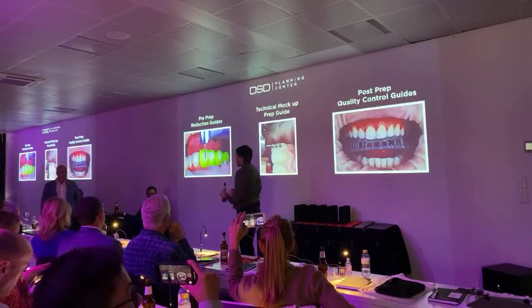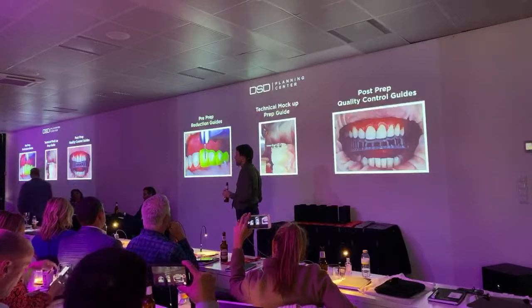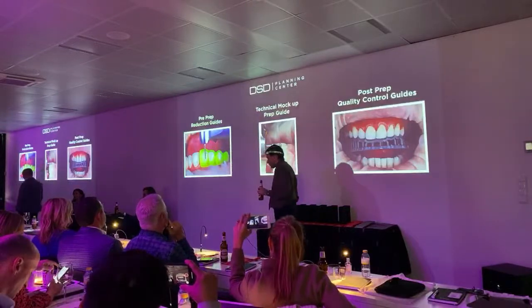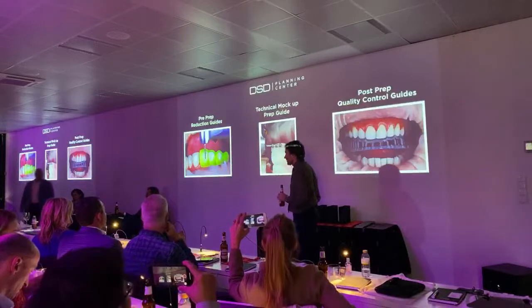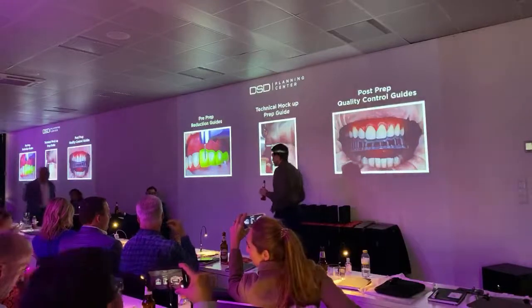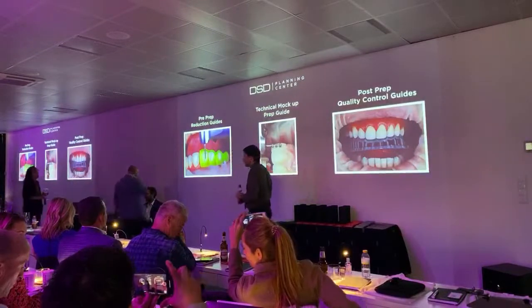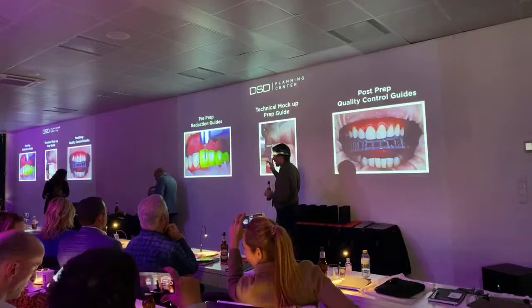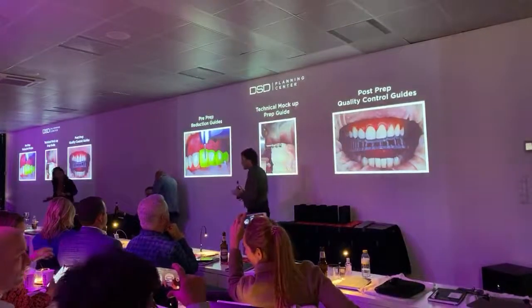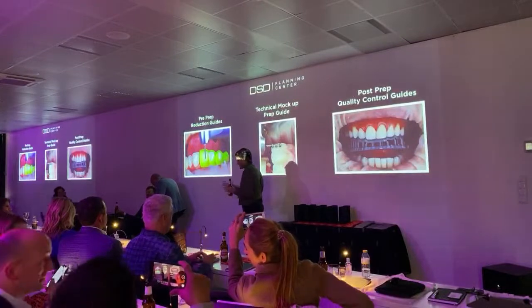Yeah, but I would rather that than having to adapt the restoration, because then it's not the match of the ideal anymore. Yeah, of course. That's an option. If the reduction doesn't affect the margins, right?